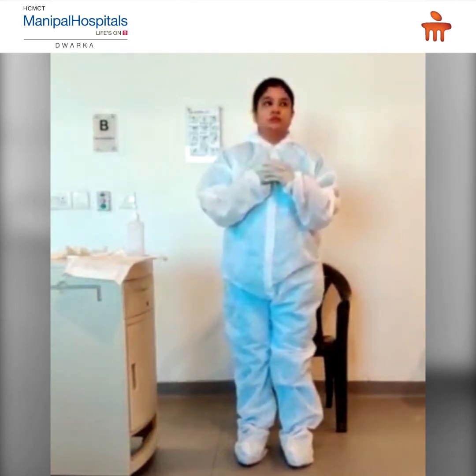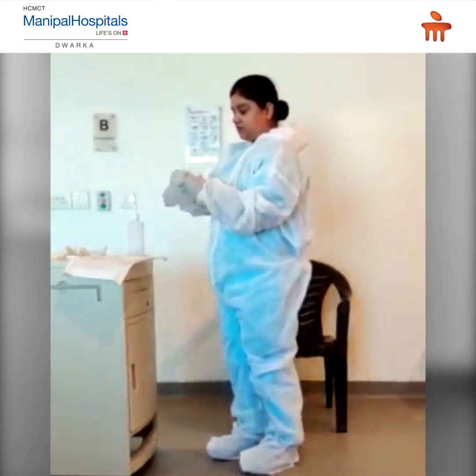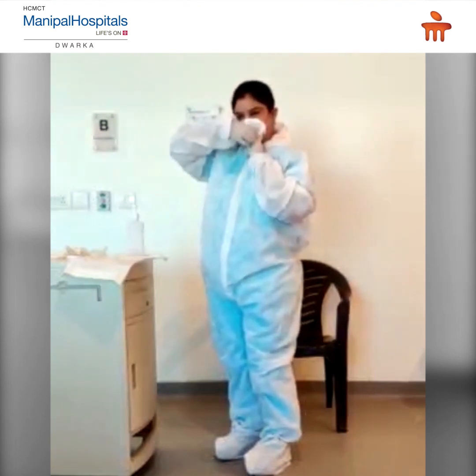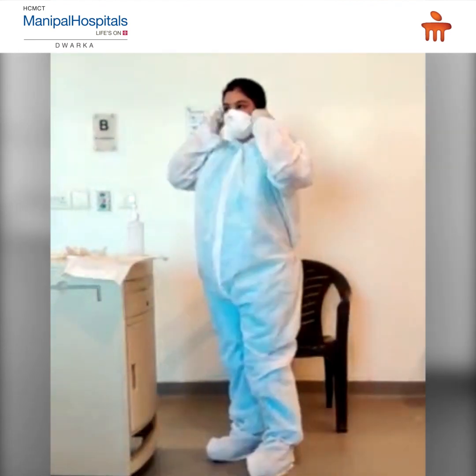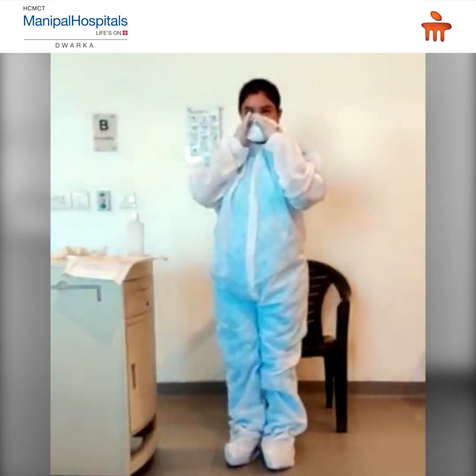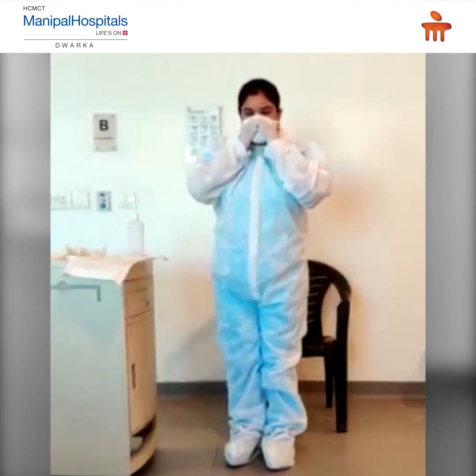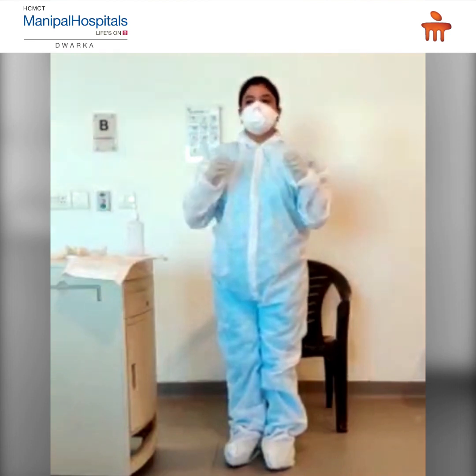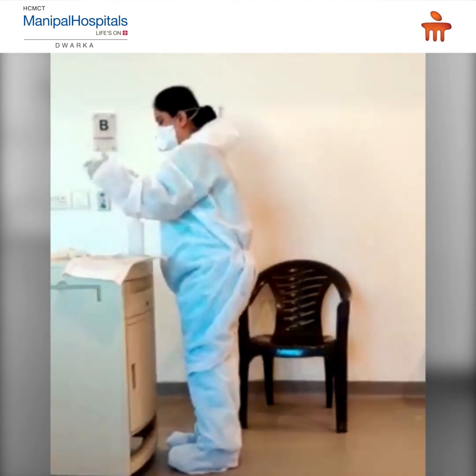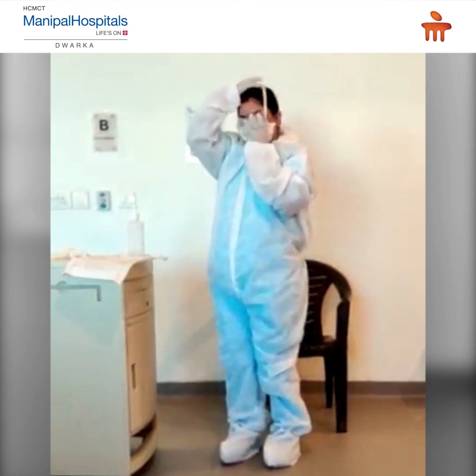Now wear the N95 mask. Fix the flexible band of the N95 mask to the nose bridge and fit-check the respirator. Now wear goggles or face shield. Place over the face and eyes and adjust for fit.